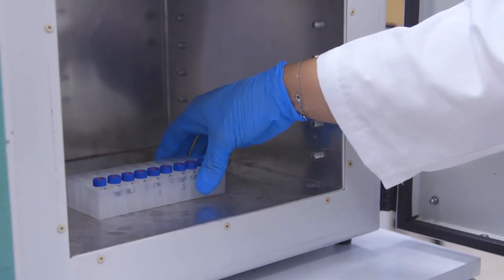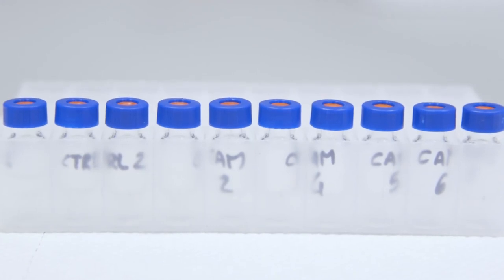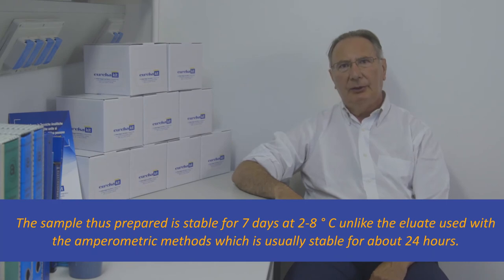We incubate our samples for 15 minutes at 70 degrees Celsius. Let them cool at room temperature. The sample thus prepared is stable for seven days at two to eight degrees Celsius, unlike the eluate used with the amperometric method which is usually stable for about 24 hours.